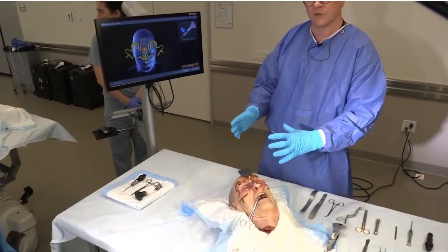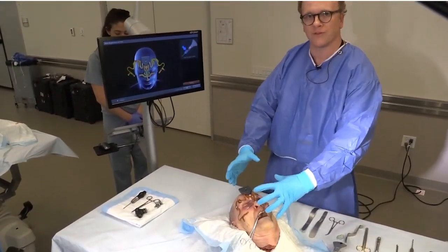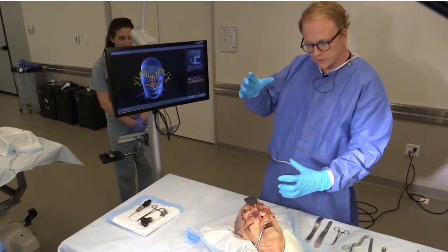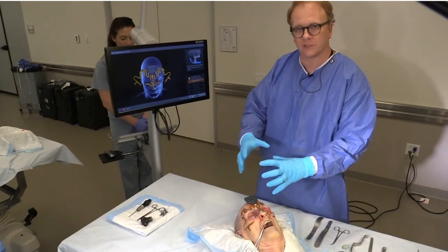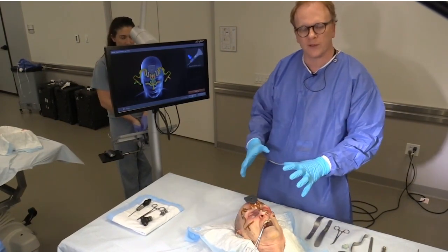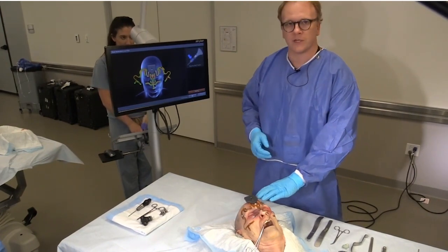Registration is the first step — matching the face, the actual face, to the map, the CT scan. Tracking is the real-time movement, being able to track different probes around the face as the face moves during the operation.